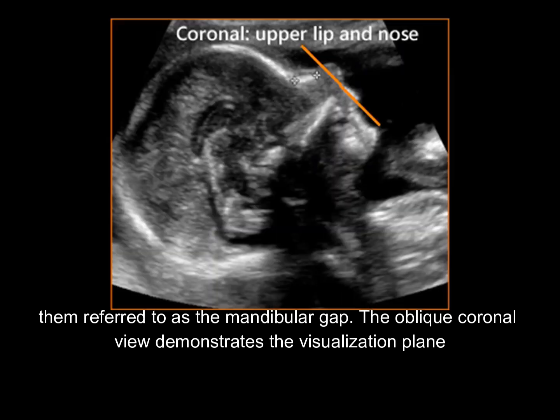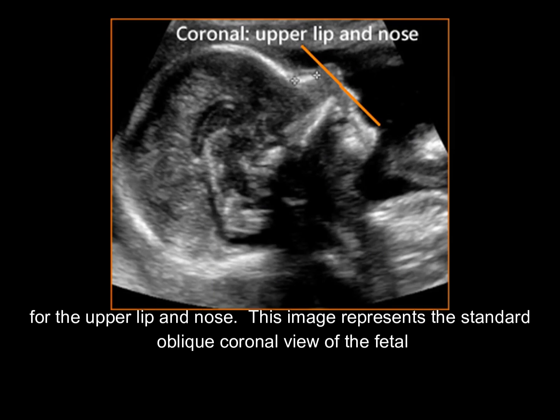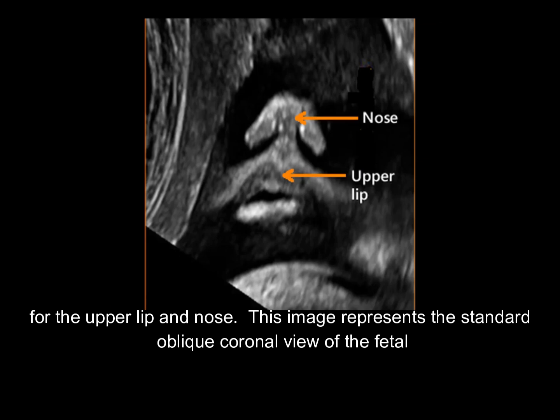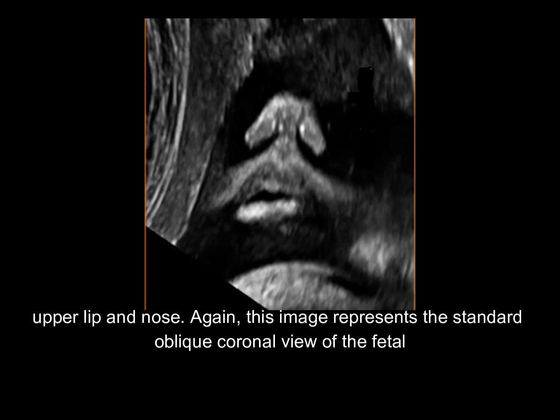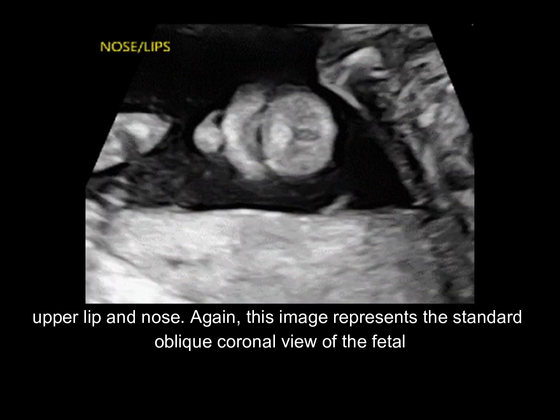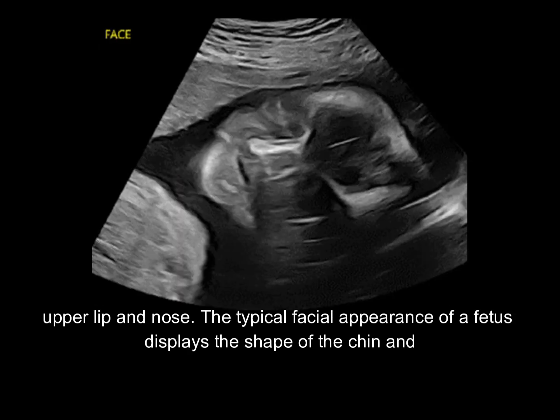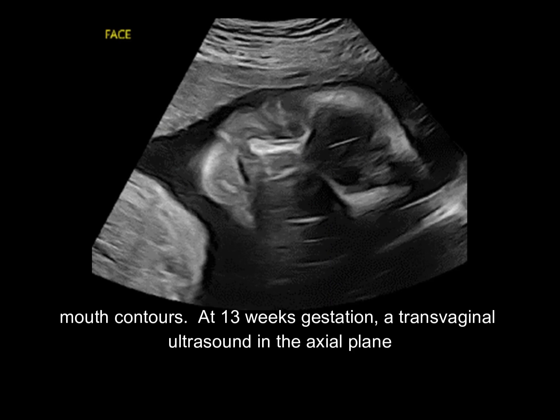The oblique coronal view demonstrates the visualization plane for the upper lip and nose. This image represents the standard oblique coronal view of the fetal upper lip and nose. The typical facial appearance of a fetus displays the shape of the chin and mouth contours.